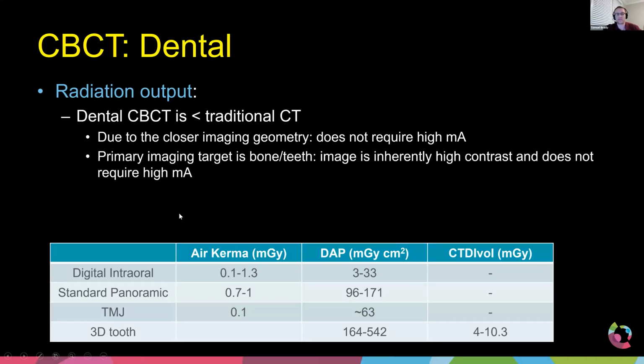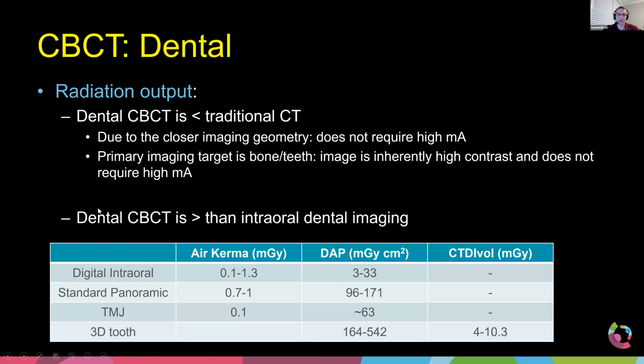And so the dose to the patient can be a lot lower. That said, these dental CBCT units are more dose than an intraoral dental imaging exam will ever produce. So here are some numbers. These are numbers I actually went out and measured so that we could just kind of talk about them.